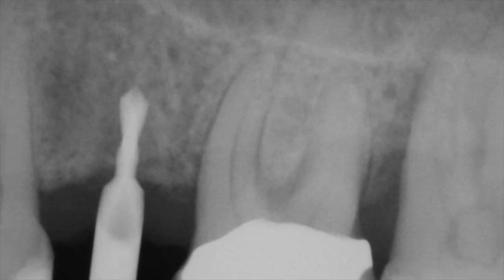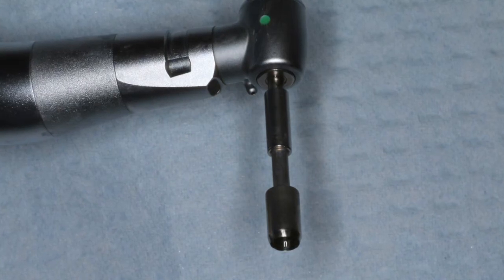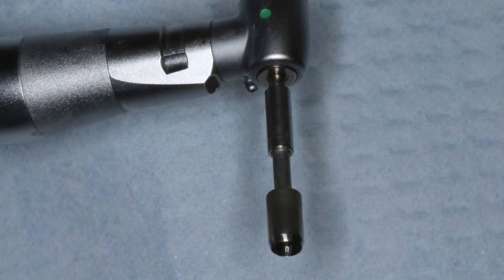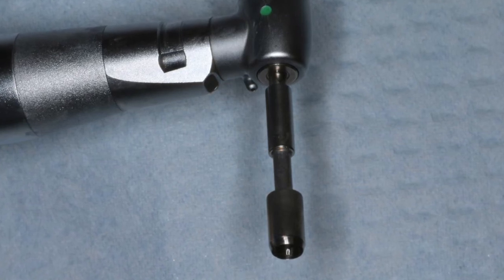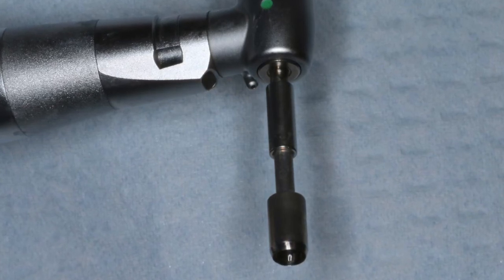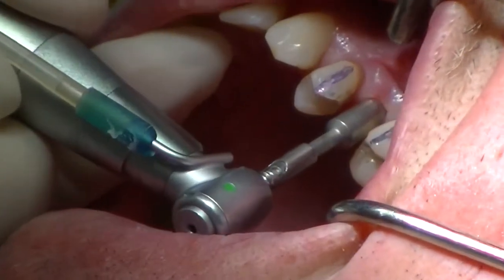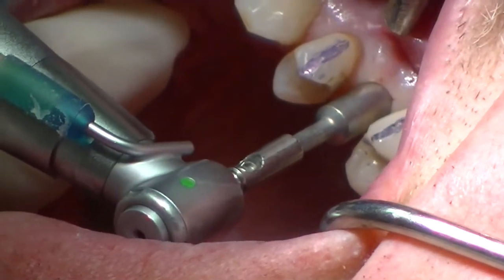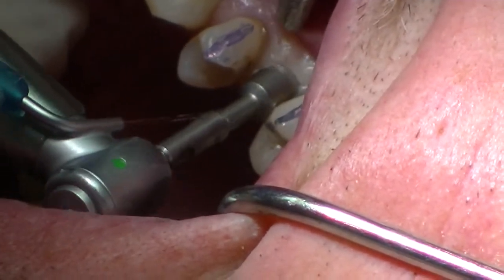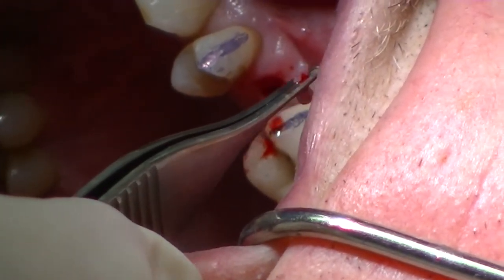I'm then going to take a punch and simply remove the soft tissue off of that crest of the ridge. The reason why I want to remove this soft tissue is because with my other burrs — my longer, wider-diameter burrs — I don't want to place the tissue into the socket site. So we're simply taking our punch and going to rotate a little bit and remove that soft tissue easily and cleanly. Taking a tissue forcep, you can see we have a soft tissue tag and a nice clean incision.